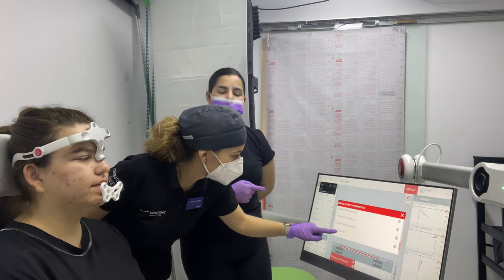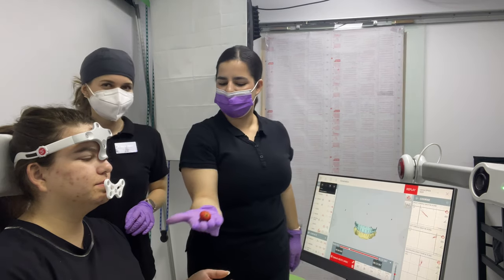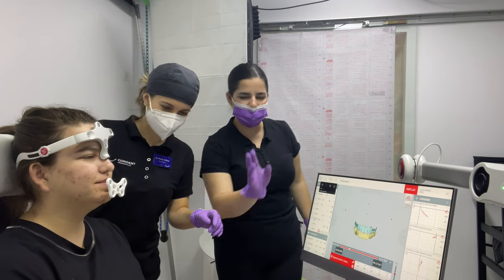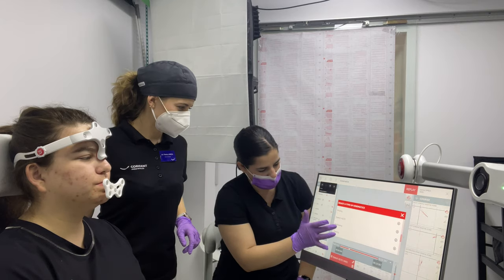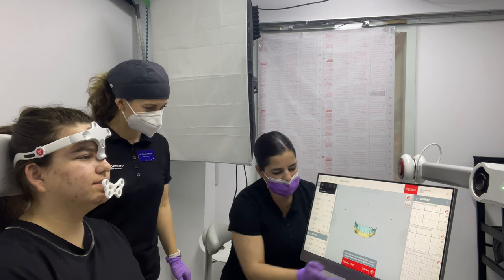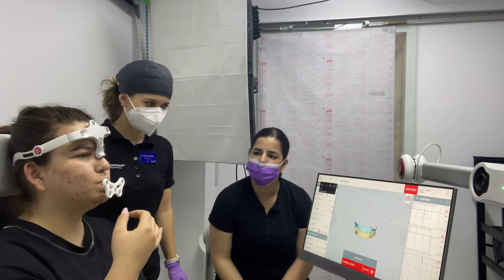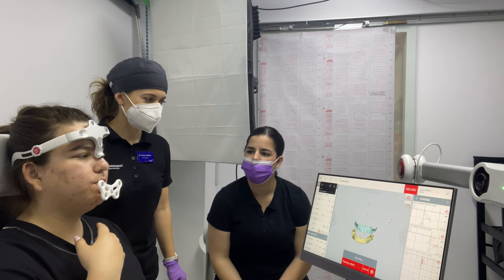Chewing. The last movement. And the last movement is chewing. Try to eat. Eat. Not yet. And now tap, tap, tap. Start. Put it. And chew it. Both sides. Also swallow.